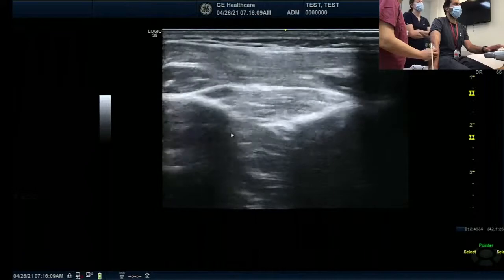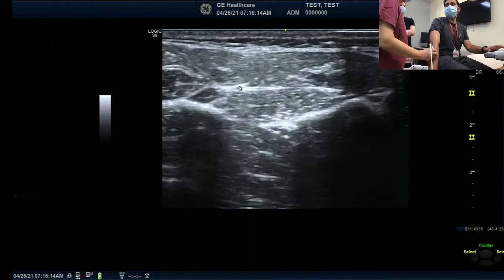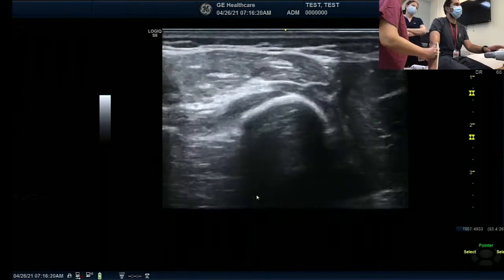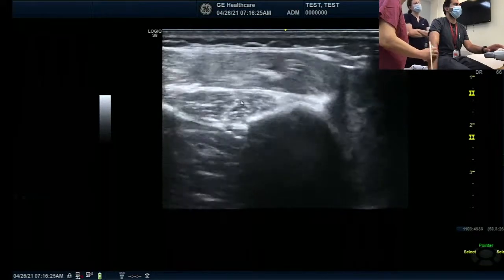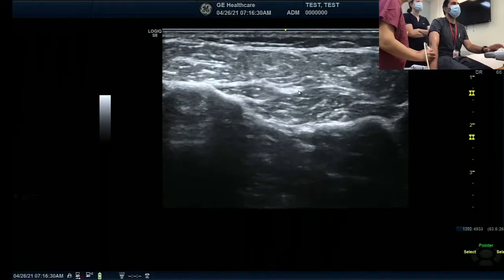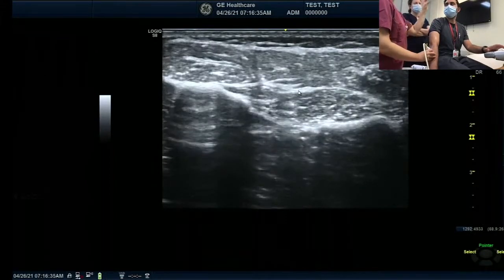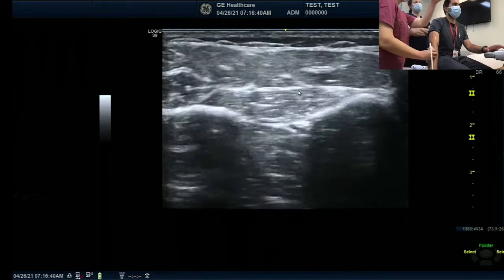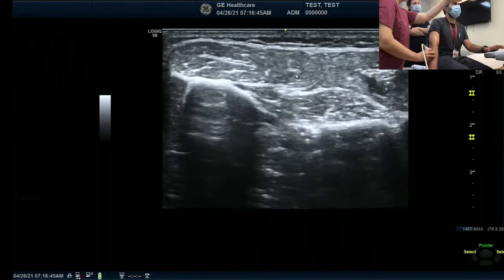So here, the radial nerve has exited the supinator, right? Let's go back to the supinator here. The supinator is exiting now. Then it moves in between the supinator, extensors and deeper extensors, right? What did we learn? The PIN supplies 3 superficial ones, 3 or 4 deeper ones. So 3 means EDC here on the right side, minimi in the middle, and then ECU.